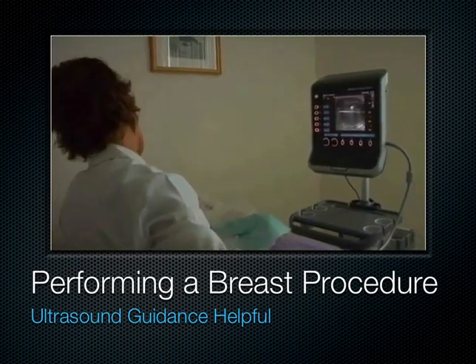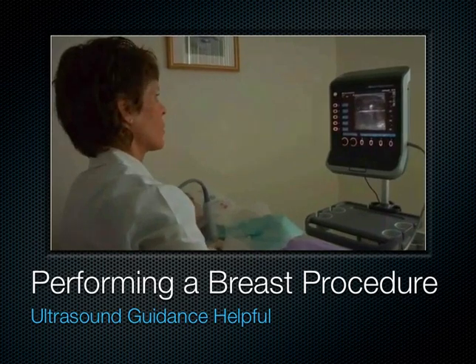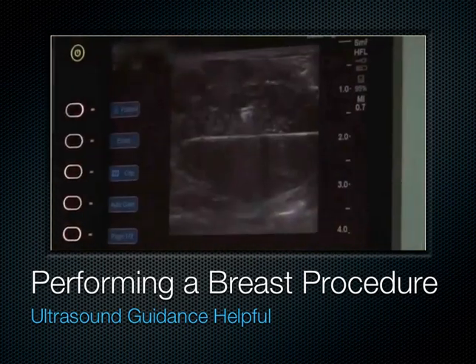So you're going to hear a lot of noises over here. You're going to hear the machine turn on, and then you're going to hear this kind of chugging noise. Go ahead.